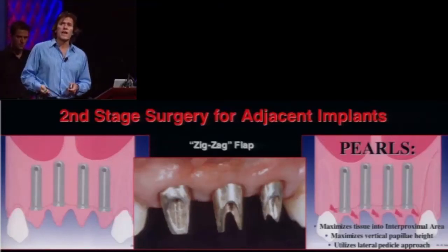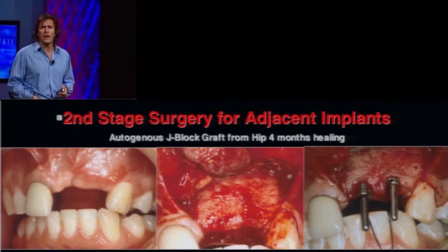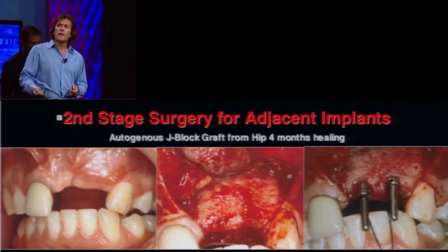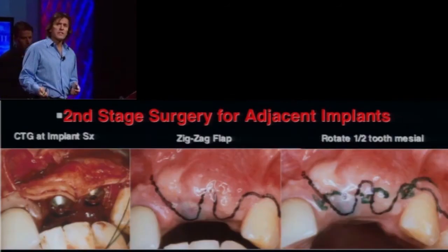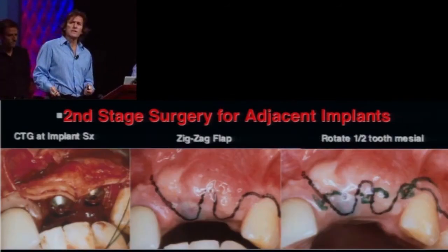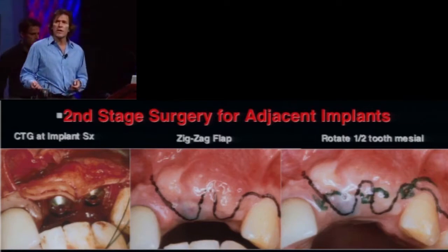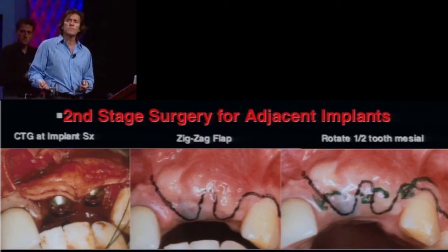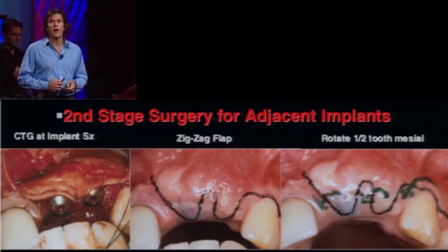And what we did in a case like this one, a large block graft, in this case taken from the anterior iliac crest, we can place our implants after 3 to 4 months of healing. We place additional soft tissue for thickness, and we're going to rotate this as a pedicle. We make a releasing incision in the bicuspid area, and we rotate the tissue over the tops of the implant 1/2 tooth over to overlap the interproximal tissues.